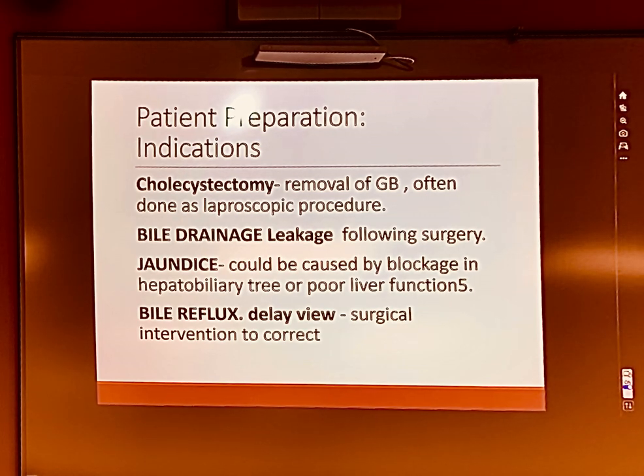So do they still do that today? It's just a change of the order of your plumbing. Do they still do it today, or is it just on patients who've had it a long time ago? Depends on how big your patient is. Sometimes it's not safe to do it any other way. Oh, so they do still do it on some patients? Okay.